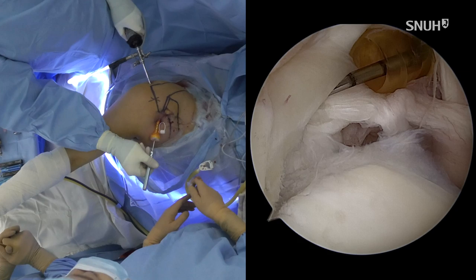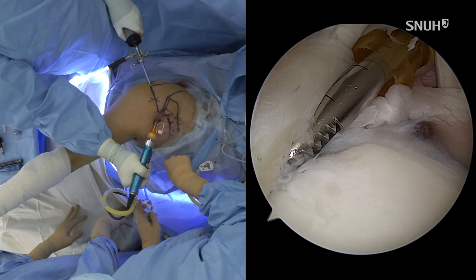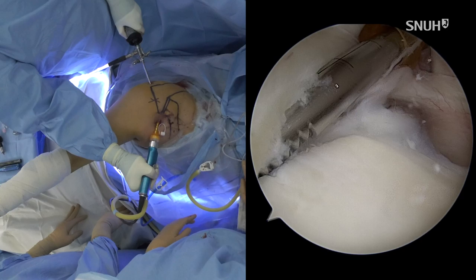Shaver. I usually remove the cartilage to enhance the labrum to bone healing. So remove the cartilage here on the superior glenoid tubercle to expose the subchondral bleeding bony surface.